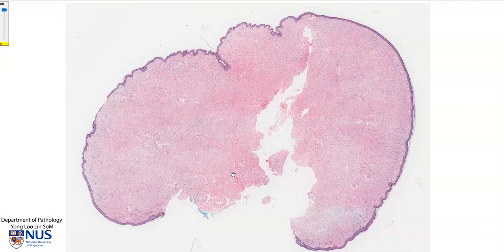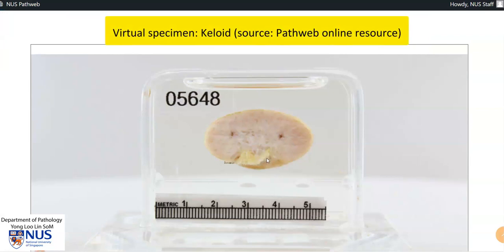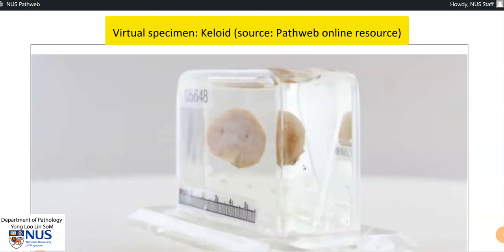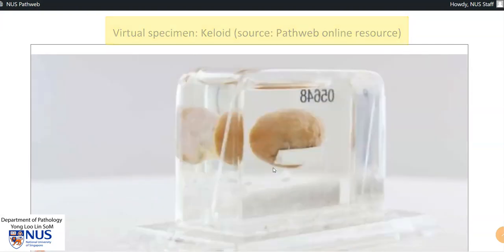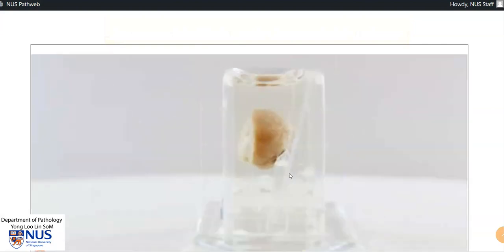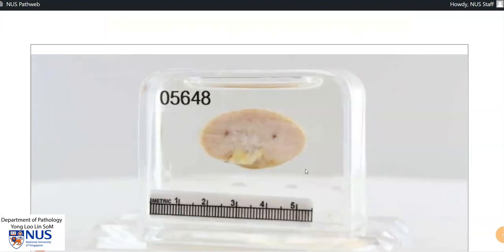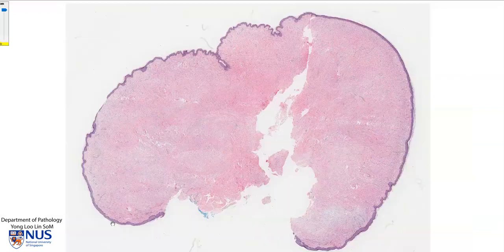Let's correlate this with the gross appearance of the cut surface. Here is the cut surface of a keloid, and we can see that there are a lot of these whitish fibers which correspond to those dense collagen bundles. This is covered by skin. Typically, this lump would appear several months after the initial injury or incision. An ear lobe is a very common location for a keloid to occur, usually secondary to ear piercing.